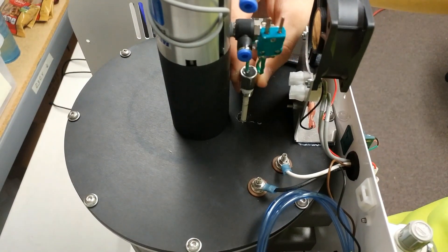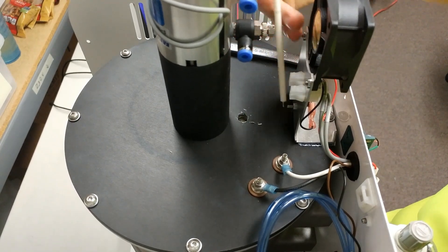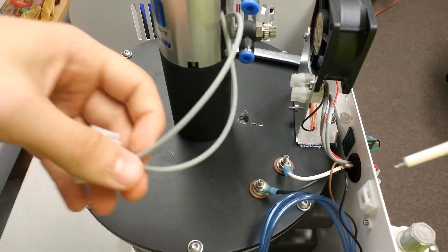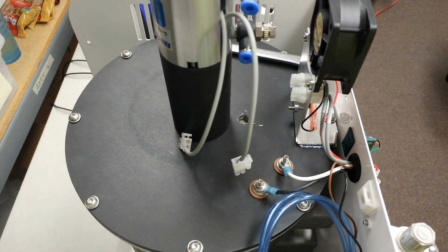Once the thermocouple is completely untightened, go ahead and pull the thermocouple out of the furnace. If you're replacing the thermocouple with a new one, go ahead and grab your new one and set it close by.